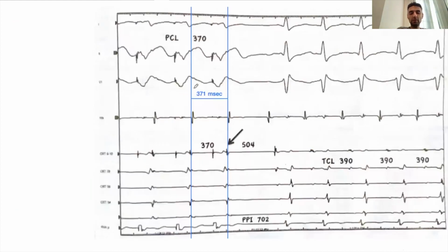Another example here, you're V pacing during tachycardia. Pacing cycle length around 370, and the tachycardia cycle length around 390. So what you note here is that the atrial activation during tachycardia is different than during pacing, right? So during tachycardia, His A is earliest. During pacing, maybe proximal CS is earliest. So you actually did not entrain the tachycardia. You rather, when you're V pacing, overdrive the tachycardia at 370 milliseconds, and then when you start pacing, you're seeing VAAV response with a long PPI.